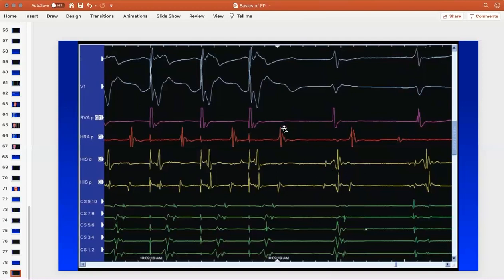So all of a sudden you blocked. Sometimes you have to think, your theory is as good as mine, but you have to tell me that as a coincidence, you blocked your A, and all of a sudden after you blocked your AV conduction, you had junctional ectopic beats. These junctional ectopic beats conduct back through an accessory pathway. I don't think it makes sense. I think it's plausible, but the better explanation is that you have an actual re-entry, V to the A to the V, V to the A. And this is a sinus beat.